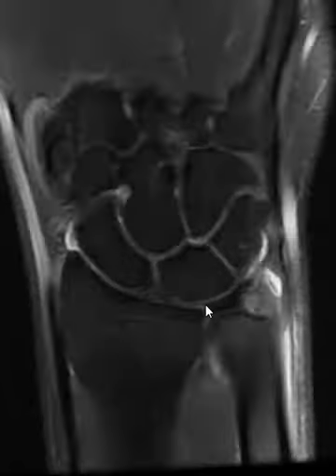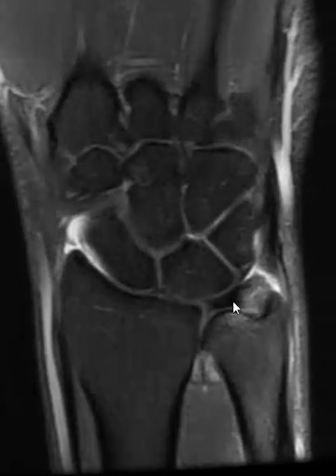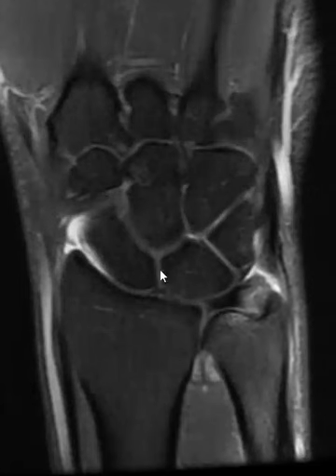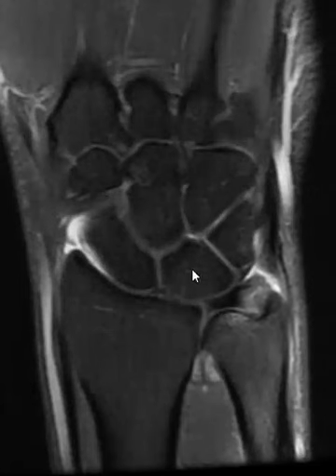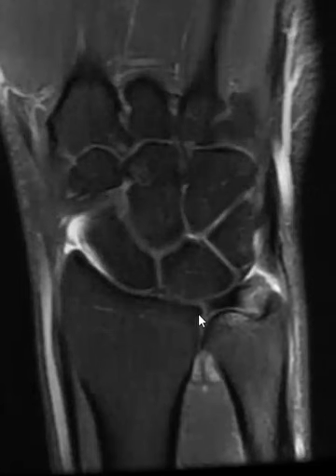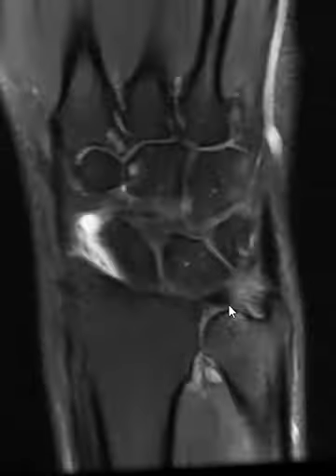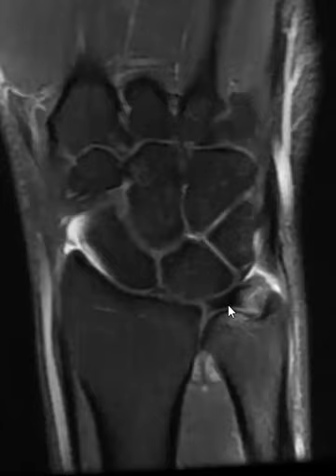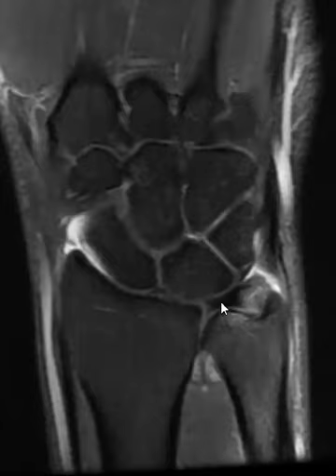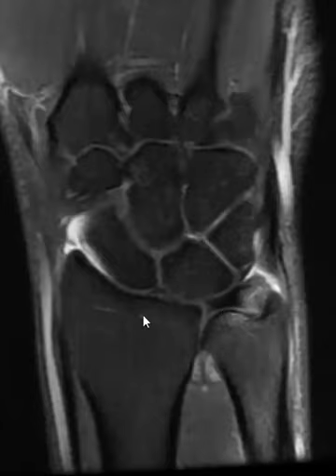We see the triangle of the fibrocartilage here coming off horizontally between the ulna and the base of the lunate bone. It attaches over here on the radius, and right in the very central portion — the epicenter — we call that the central disc. It's a nice big fat central disc.